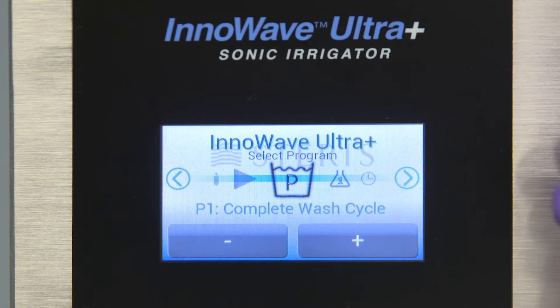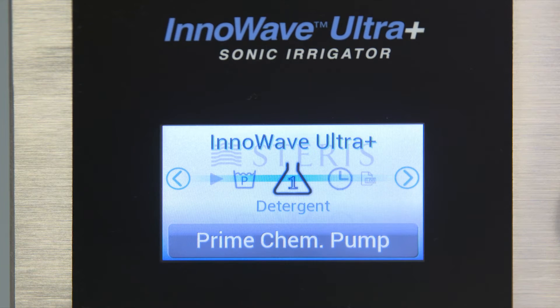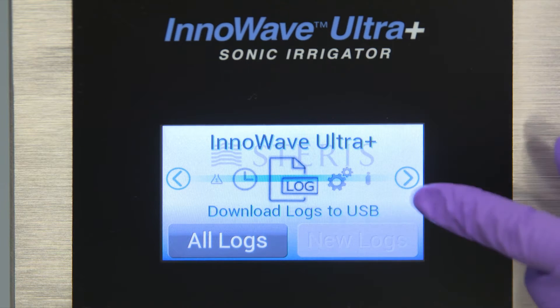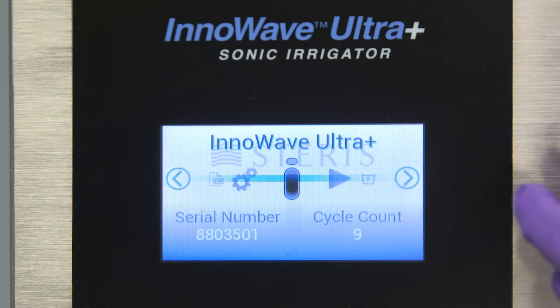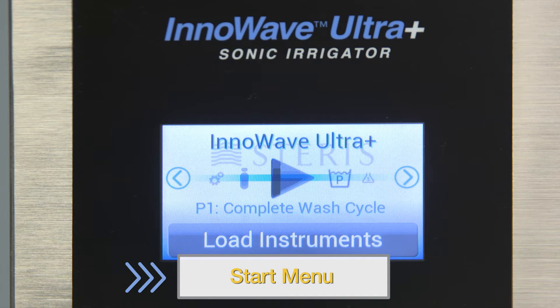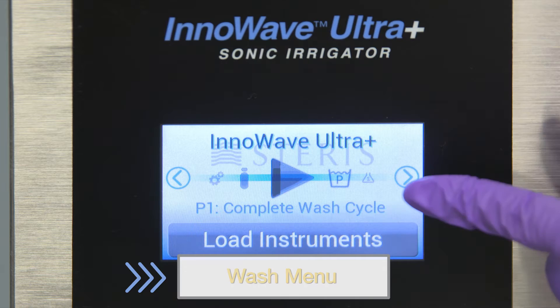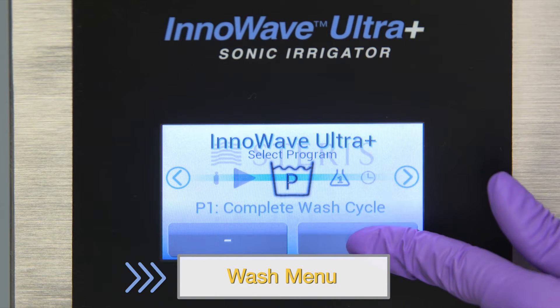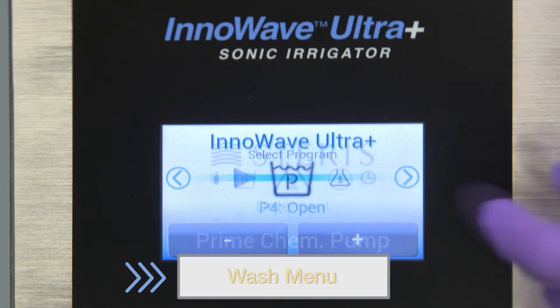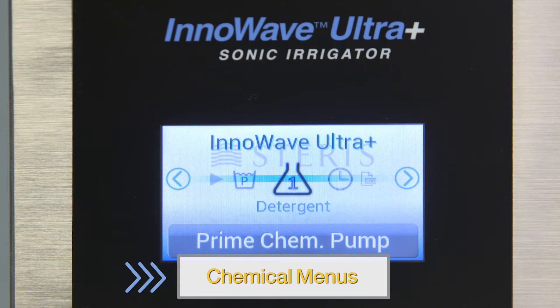Use the touch screen to operate your ultrasonic irrigator. The menus help you perform various functions. Use the right and left arrow keys to scroll through the control screen. Use the Start menu to begin an automated cycle sequence when it's time to wash a load. The Wash menu lets you select the correct cycle from the list of pre-programmed and custom cycles. Use the Chemical menu to prime the chemistry pump. We will cover priming the pump later in this video.